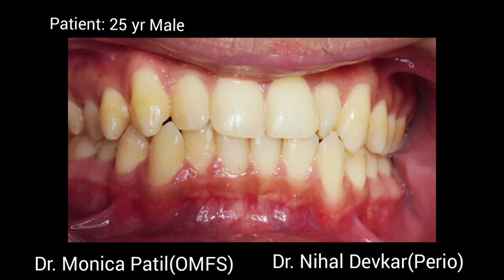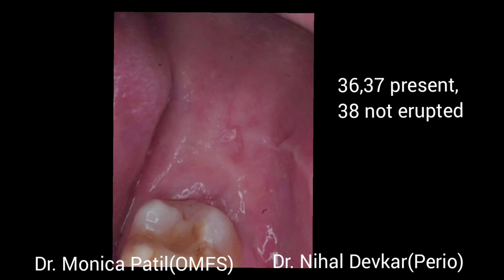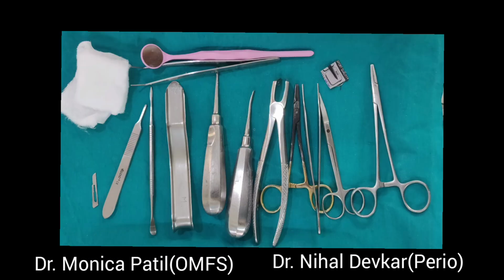Let's go through this case. The patient is a 25-year-old male and complains of pain while opening the jaws. Clinical examination showed that 36 and 37 were present, but 38 was not erupted, and there is adequate keratinized tissue behind. The IOPA X-ray showed a horizontally impacted 38, which is pressing onto 37. The case is prepared for disimpaction.